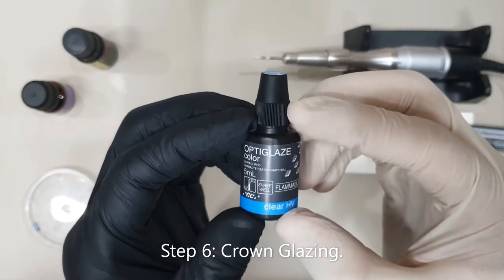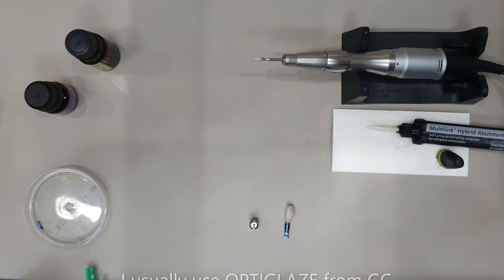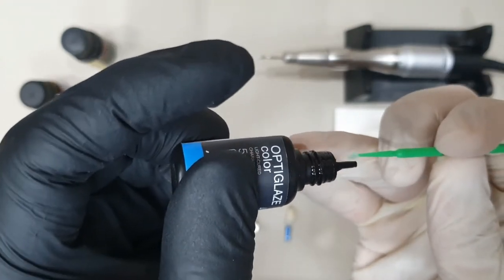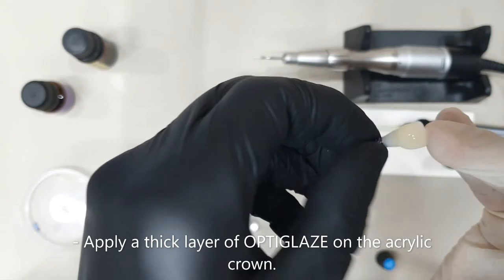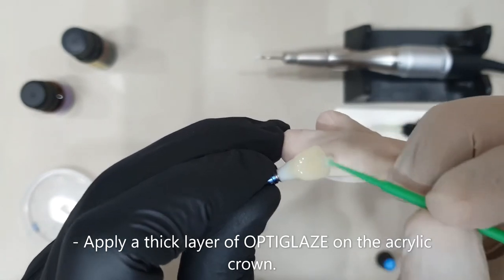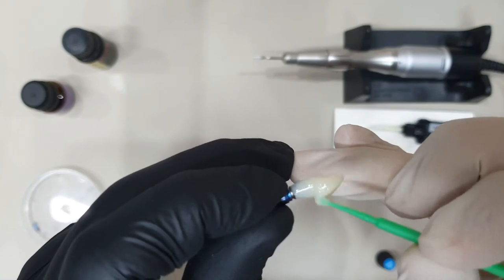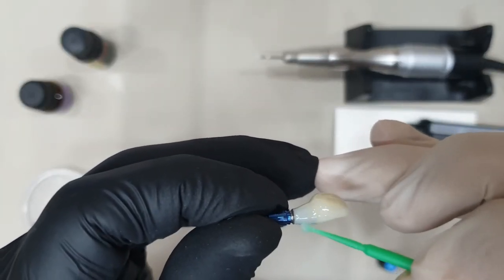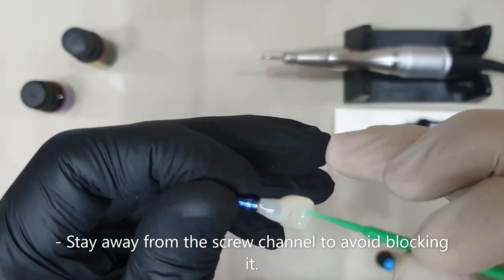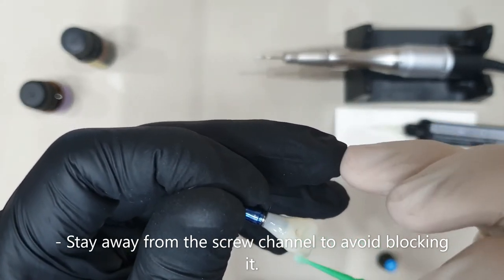Now it's time to do the glazing process. For that I use OptiGlaze from GC. Apply a nice and thick layer of OptiGlaze on top of your crown, just to make sure that you have a good long-lasting layer and that your crown looks really nice. Try to make sure not to put too much glaze material around or inside of your screw channel, just to make sure it will be nice and clear.